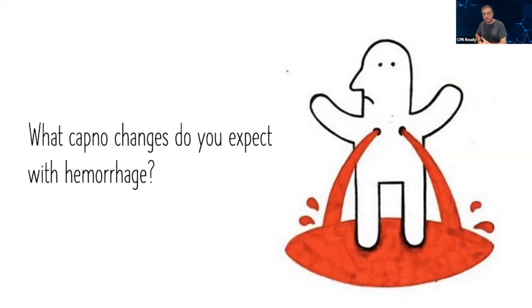What would you expect your capno to be? Would you expect it to be normal? Would you expect it to be high, or would you expect it to be low? What do you guys think for your trauma patients? Okay, I got high. Anyone else differ? In the chat here, lower perfusion equals lower capnography.